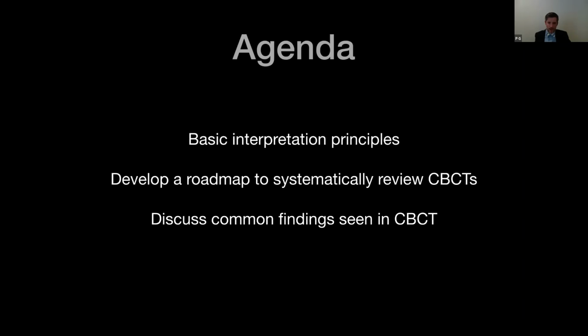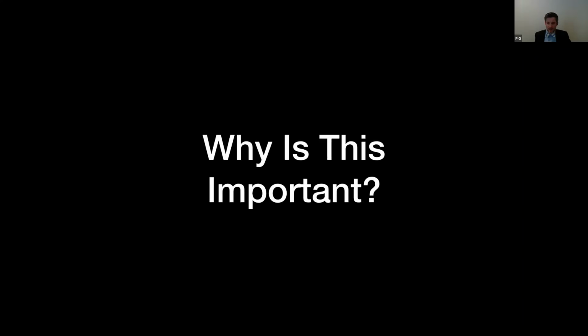And then at the end, we'll end with some common findings that I tend to see often when I go through scans. So let's get right into it. It's Friday night and learn about some cone beam.